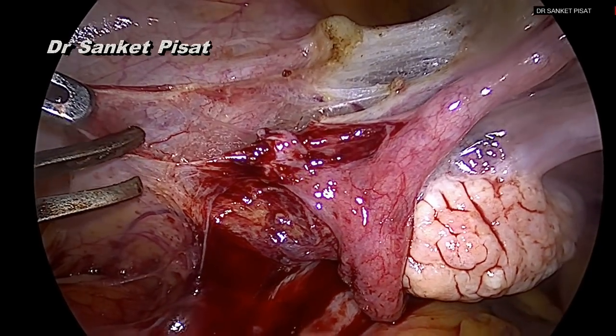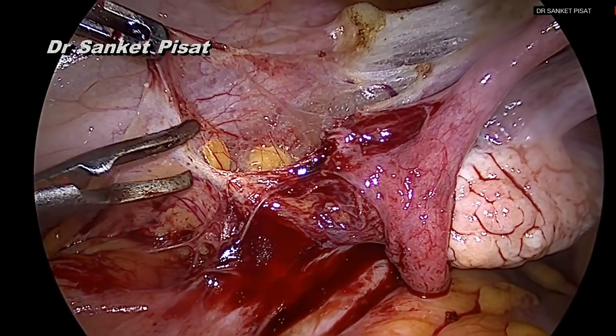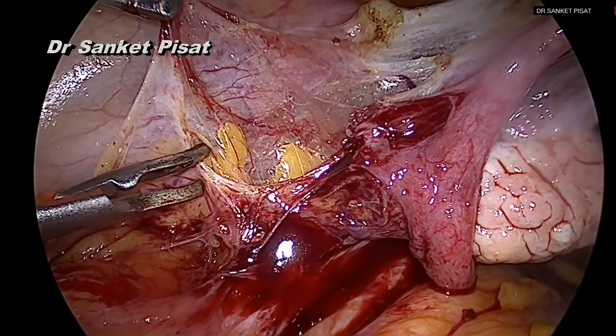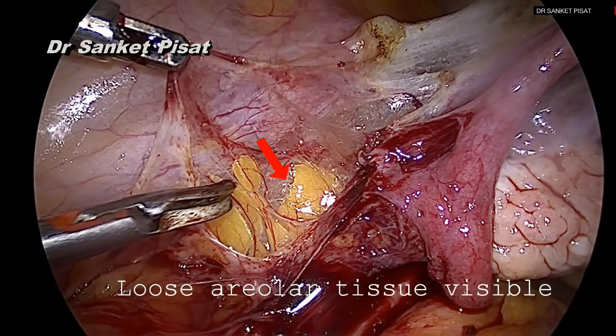However, proceeding by this way ensures that the surgeon will be able to see all the vital structures in the pelvis and not confuse one structure from the other before the uterine artery ligation is performed. As the incision is extended up to the infundibulopelvic ligament, the loose areolar tissue of the retroperitoneum starts becoming visible.